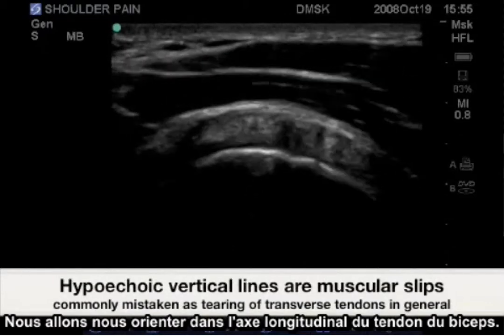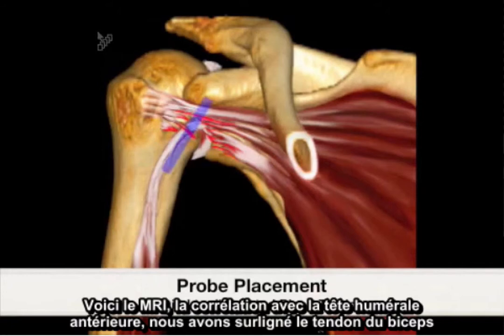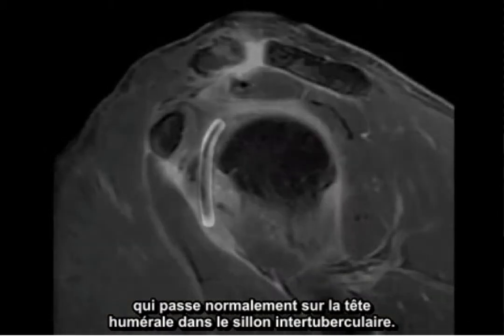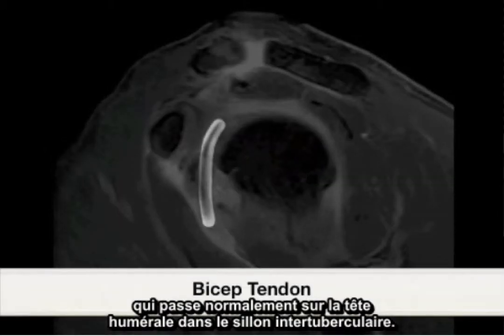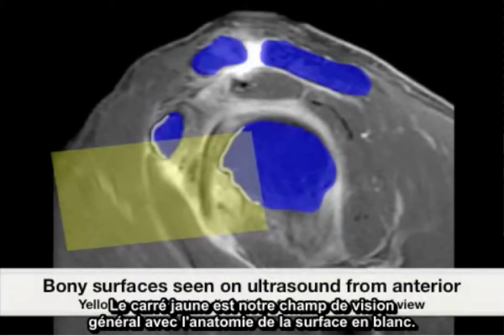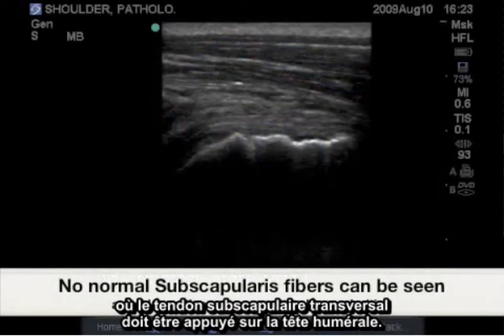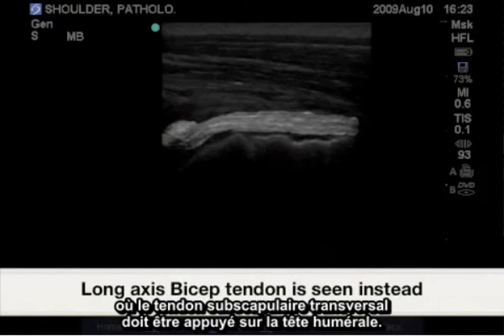We will orient ourselves to the long axis of the bicep tendon. Here in this MRI correlation over the anterior humeral head, we have highlighted the bicep tendon coursing over the humeral head where it should be in the normally situated bicep groove. Here in the yellow box would be our general field of view, with the surface anatomy in white, showing the bicep tendon in long axis where the transverse subscapularis tendon should be resting over the anterior humeral head.